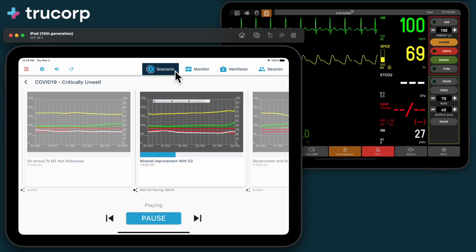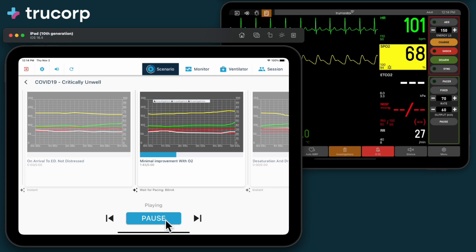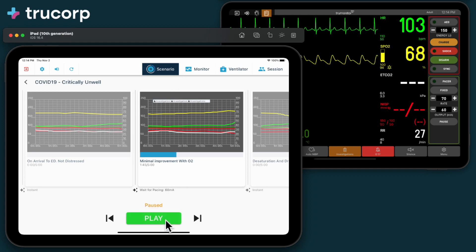You can skip back and forward, pause and resume your scenario to assist your simulation.